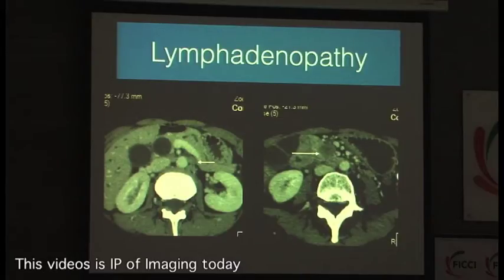That means to the left of the SMA. They will generally not go too much to the left of the SMA. If it is not too far and you tell them, yes, I feel there is a single node that I can see, to the left of the SMA, he may make an effort. But lots of people will not include any lymph node to the left of the SMA as a loco-regional lymph node, which they will take out, right?